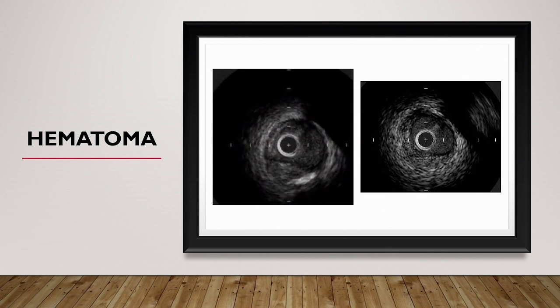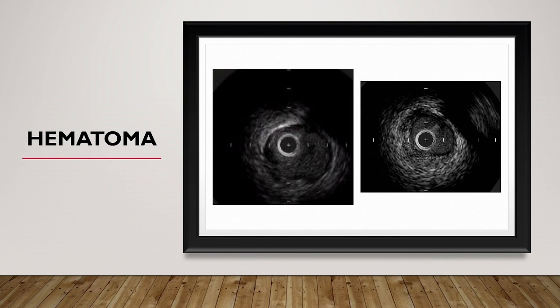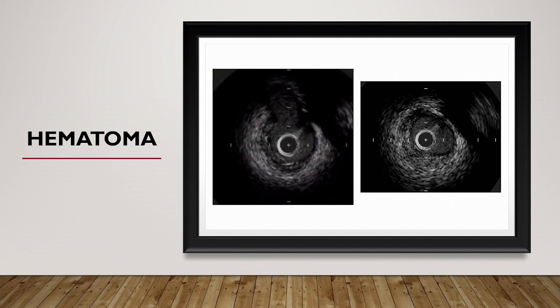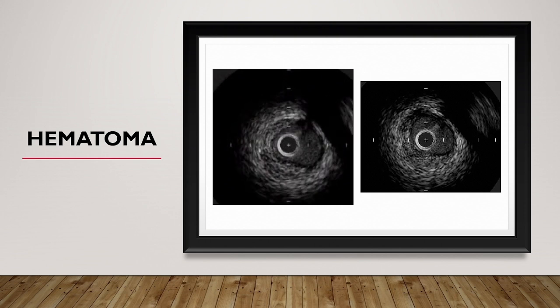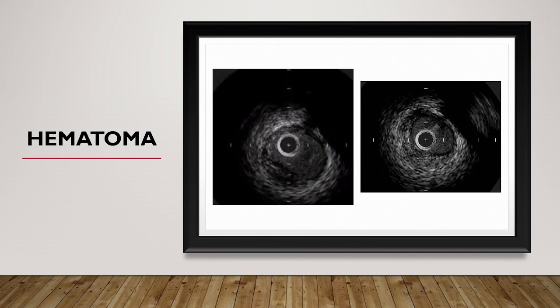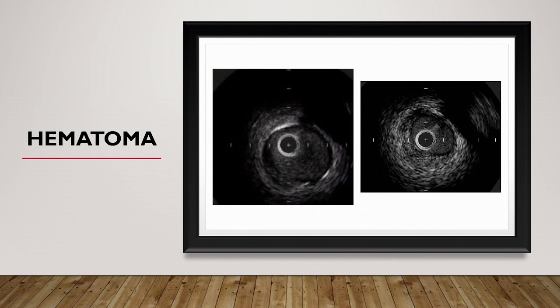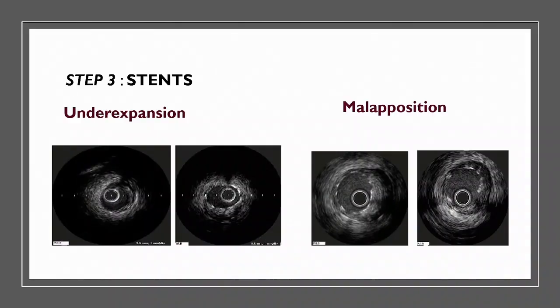And this is hematoma, this helmet shape, which is separating the intima from the media, and it's a subintimal collection. So this helmet shape thing is a hematoma. A large hematoma has been correlated with stent failure. If it is a stent-edge hematoma, it should be treated.